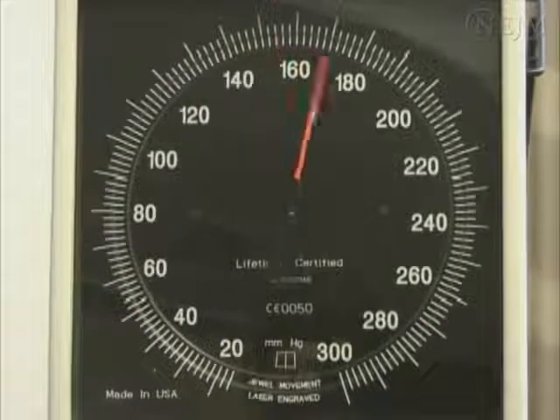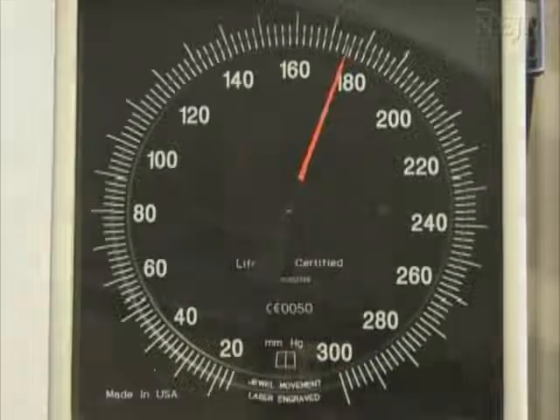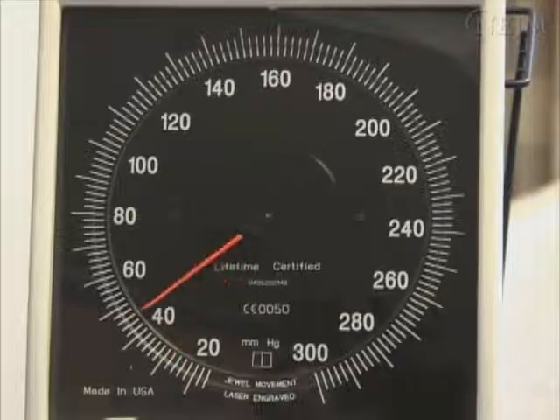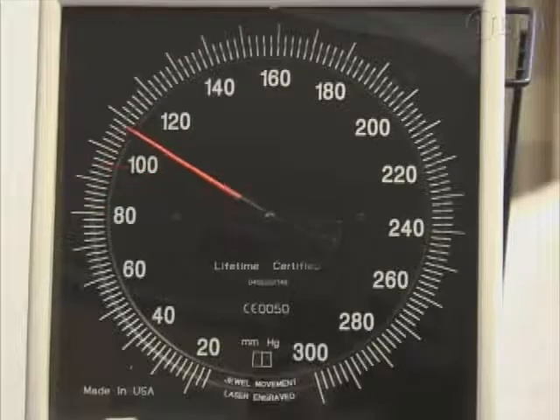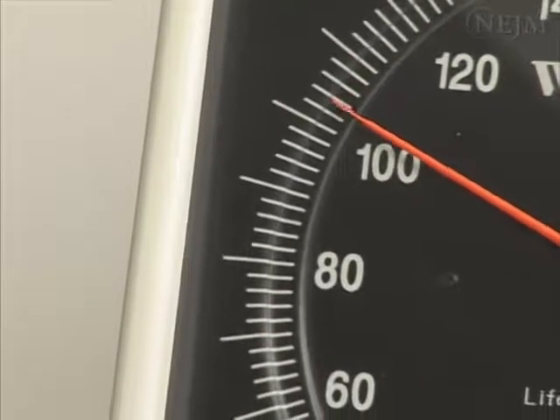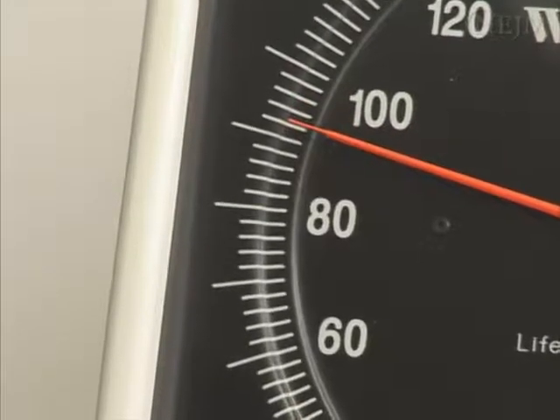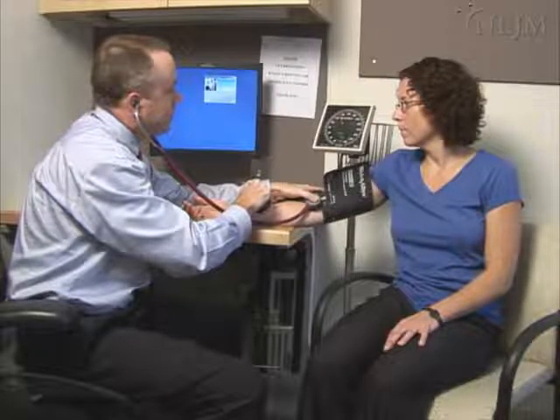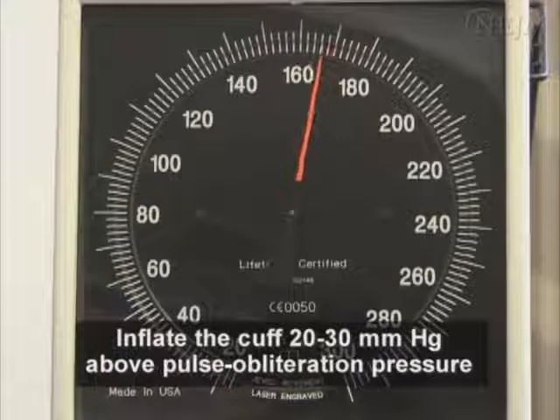Inflating the cuff to some arbitrary level runs the risk of excessive overinflation. To avoid this, determine the measurement of the pulse obliteration pressure. Rapidly inflate the cuff to 80 millimeters of mercury while palpating the radial artery pulse. Continue to inflate in 10 millimeter of mercury increments, taking note of the reading at which the pulse disappears. Then deflate the cuff at a rate of 2 millimeters of mercury per second, noting when the pulse reappears. Once the pulse obliteration pressure is determined, you are ready to measure the blood pressure. Inflate the cuff to a level 20 to 30 millimeters of mercury above the pulse obliteration pressure.